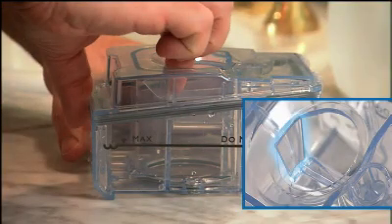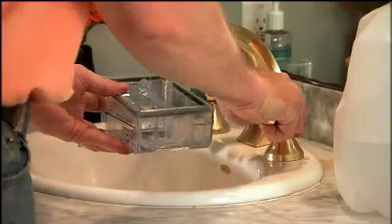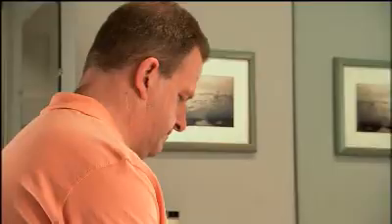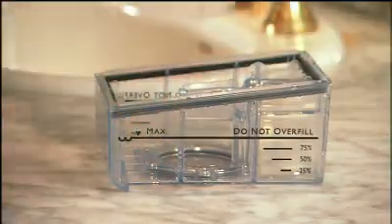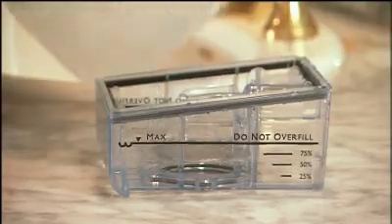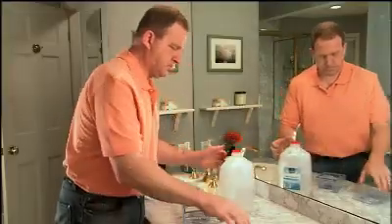Gently push the tab located inside the round opening on top of the tank. Separate the top and bottom of the tank. Rinse the tank out with tap water. Set the bottom tank on a flat surface and add distilled water. Fill only as high as the maximum fill lines located on the sides of the water tank.